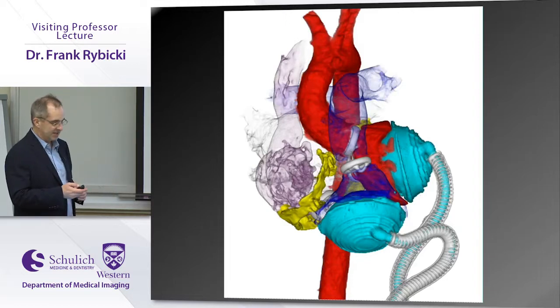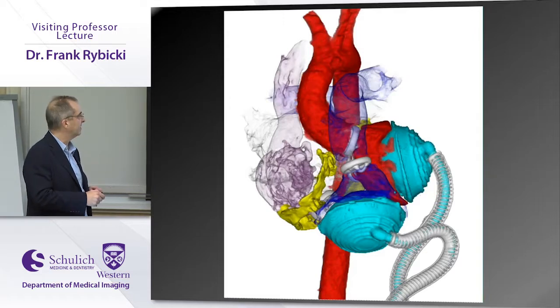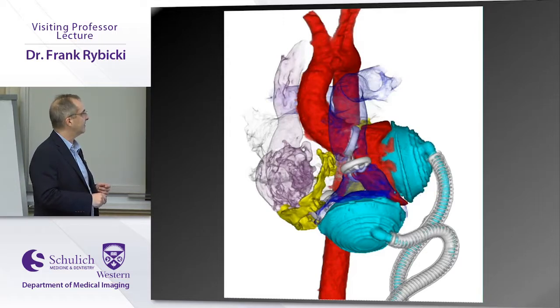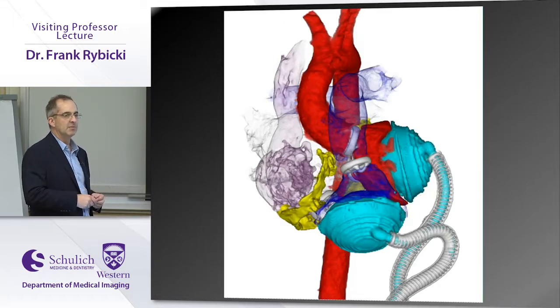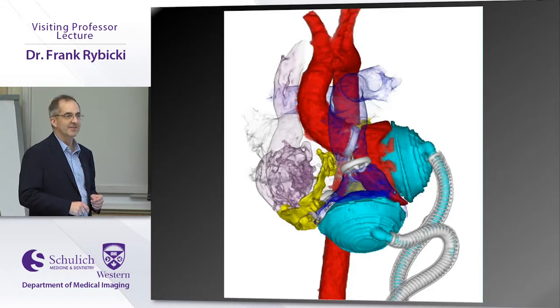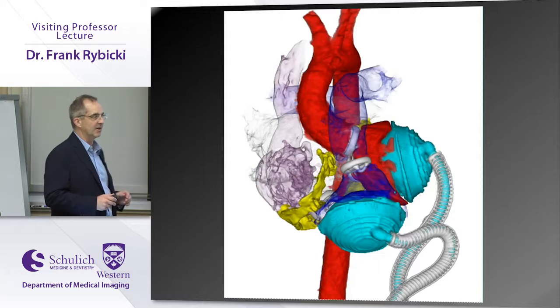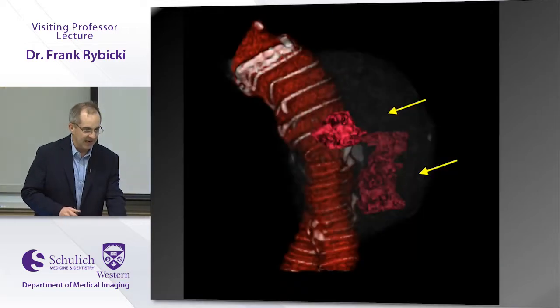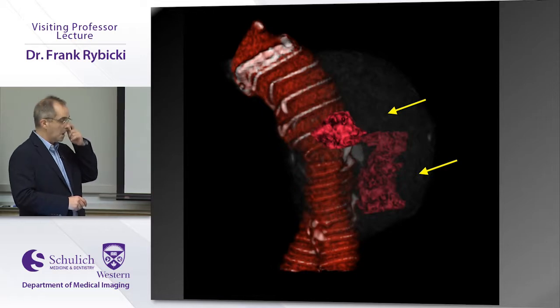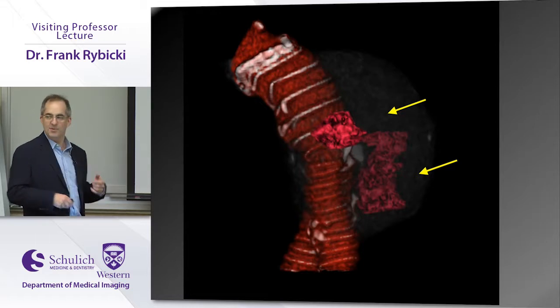So this is a volume rendering from one of my old fellows, one of my old mentees. I've had almost 100 mentees now who have gone into bona fide academic radiology. And it's pretty artistic. This is a mechanical heart, and this is a CT scan, right? It's a completely reformatted and colorized CT scan using Vitrea. There's a lot of artistic component. This is Shapour-Dimitri's paper, a recent Radiology paper where he's talking about endoleaks and quantitating them. If you take the arrows out, there's a huge artistic component.